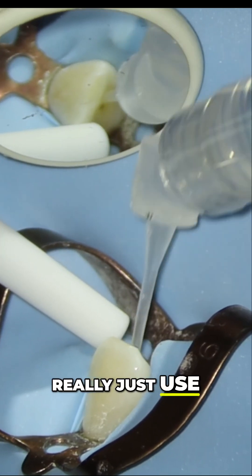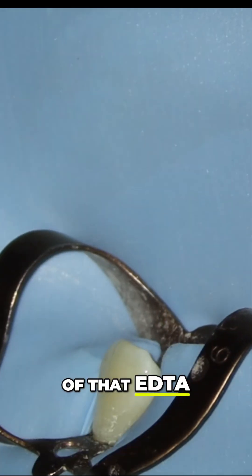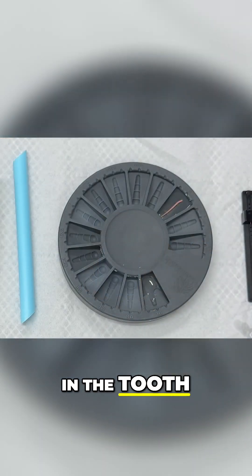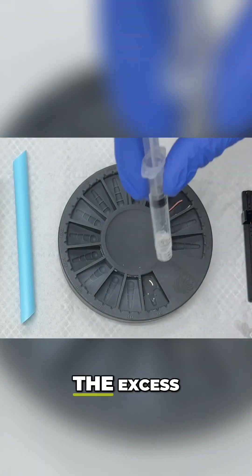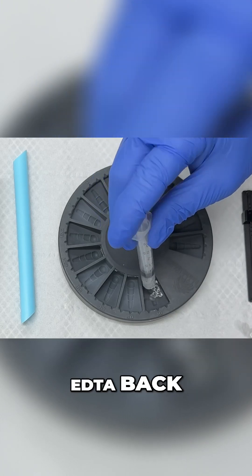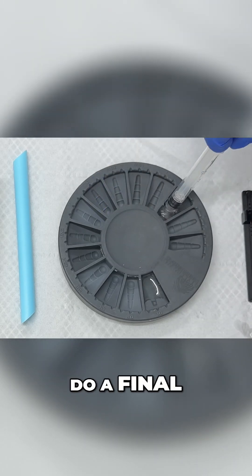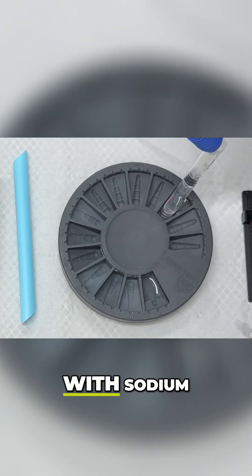Really just use all of that EDTA to remove that smear layer in the tooth. I'm going to push the excess EDTA back into where it was, and then I'm going to do a final rinse with sodium hypochlorite.